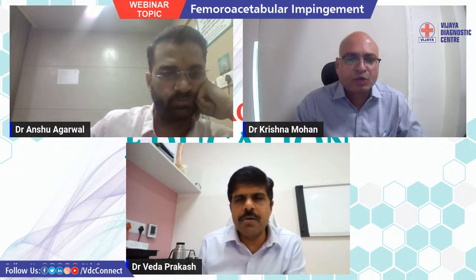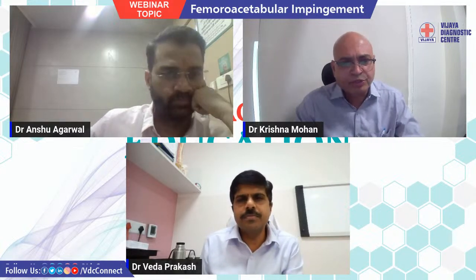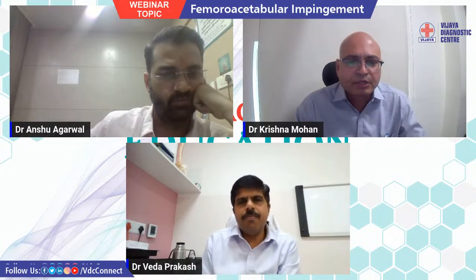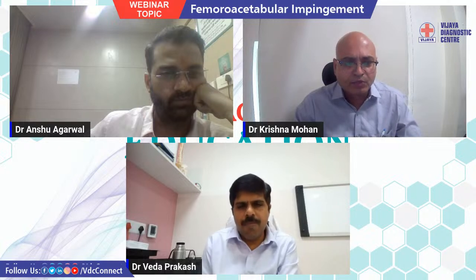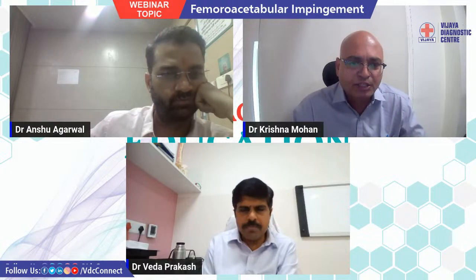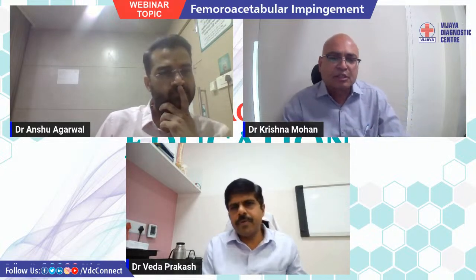Yes, a high resolution 3D volume sequence we have to do for a specific hip, right hip and left hip separately. That 3D high resolution imaging we have to acquire and study for the labral tear, definitely. Otherwise, if we do the entire hip at one go, like an entire pelvis, which we usually study when we do hip joints, then the resolution may not be adequate to study the labrum. So we definitely do a dedicated hip MRI.